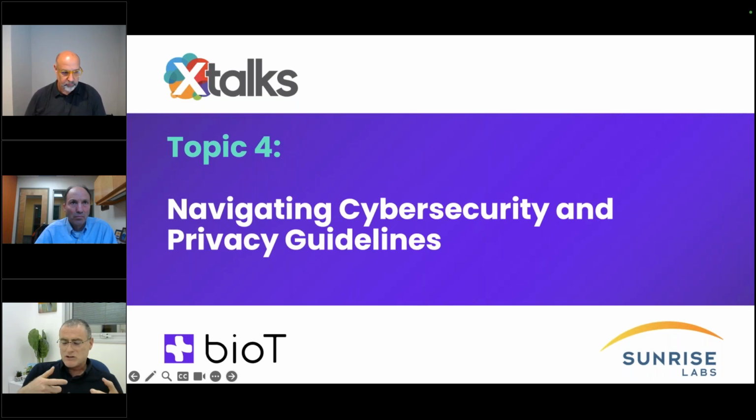Once you're exchanging data, even operational data about a bug, someone opens a ticket and attaches a log file from the system that might contain PHI. It's okay if the log file contains PHI, but you need to make sure that it transits only in places which are protected and can carry personal healthcare information. So be careful using things like Slack or others if you are not using their infrastructure that protects PHI. These are other important points to stress.